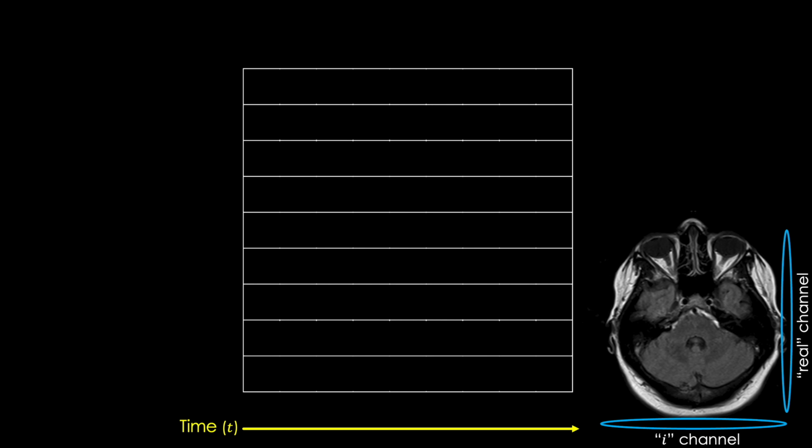We start the cycle as always with our RF pulse. And now that the system has been energized, we blip on and off our gy gradient for a set amount of time to get our first ky value. We do additional pulses or gradients to make an echo emerge, at which point we turn on our gx gradient while recording the current our echo generates in our coils.